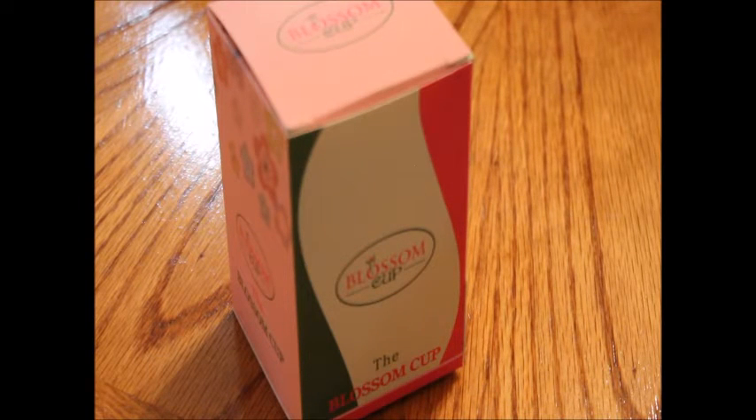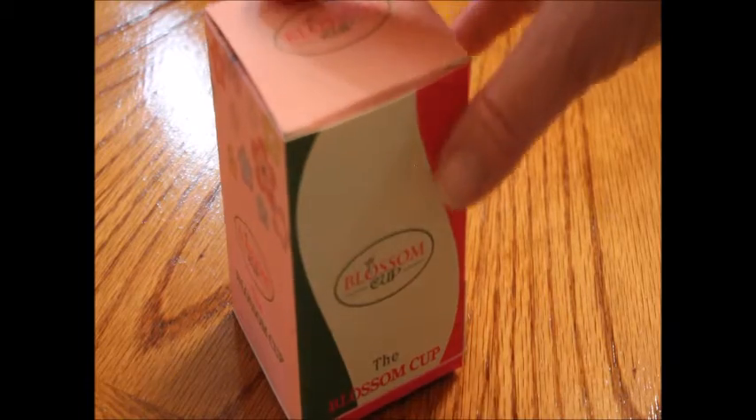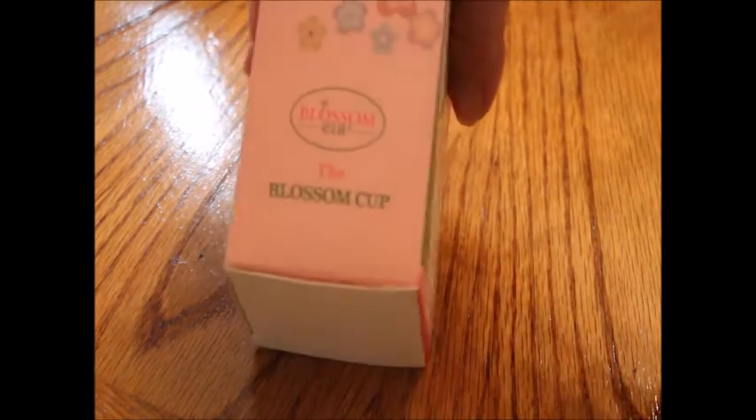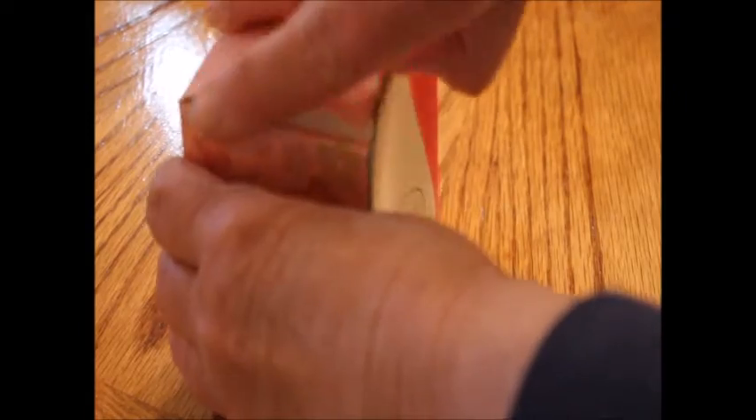Hello, everyone. Terri here from shabbycheekboho.com, and I got in a blossom cup for review, and I wanted to show it to you on a video. Sometimes that works better than taking pictures for me.